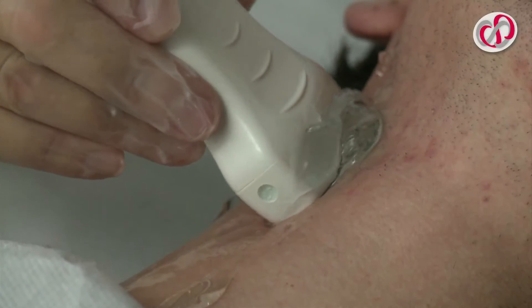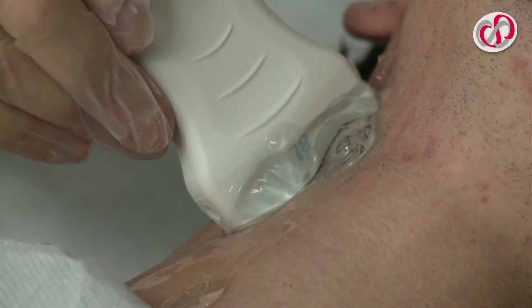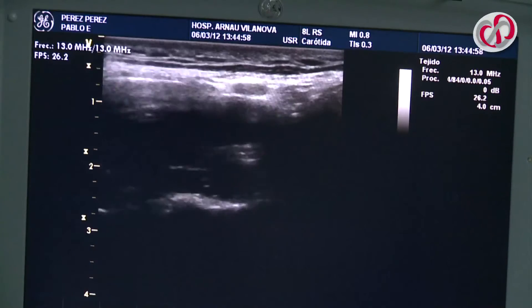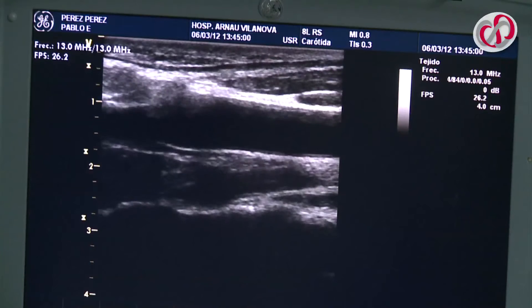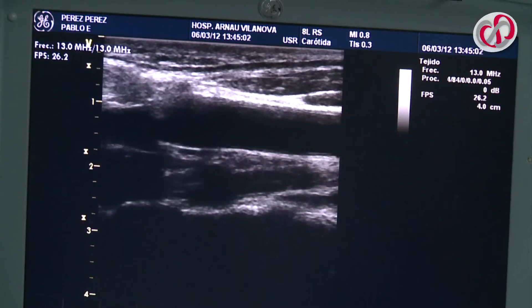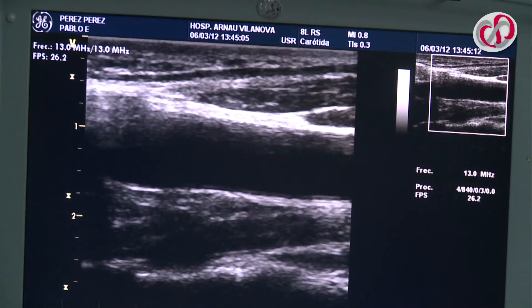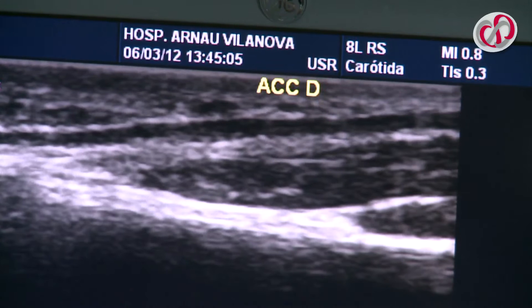We rotate the probe to a longitudinal position at the level of the carotid bulb in order to obtain a good image of the common carotid and the bulb. The image is captured, the segment is identified, and saved.